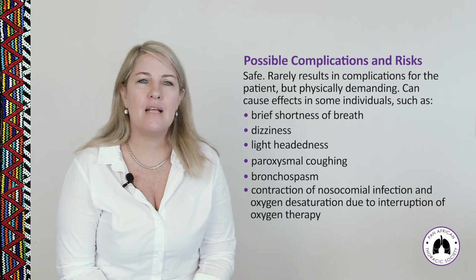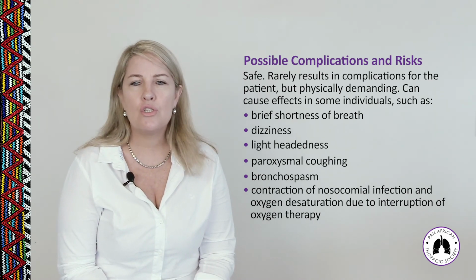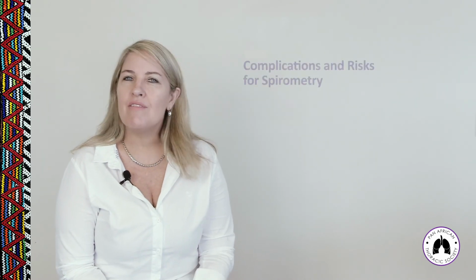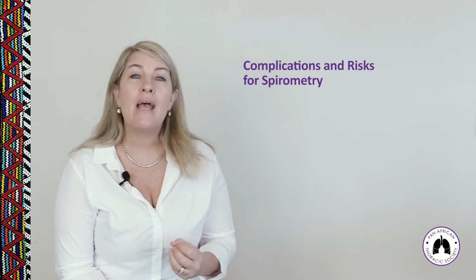Any effects that a child or a patient may have with a spirometry test is usually short-lived and resolved shortly after the test.